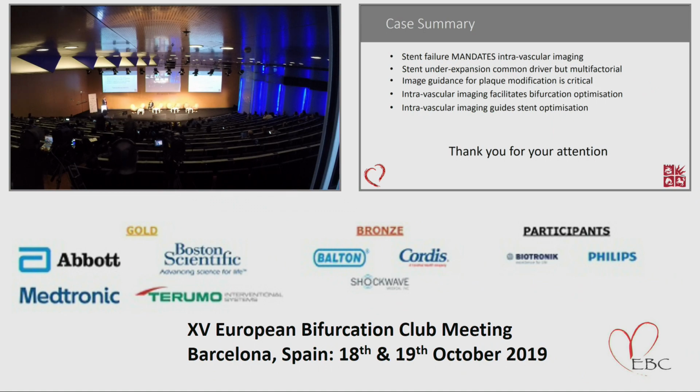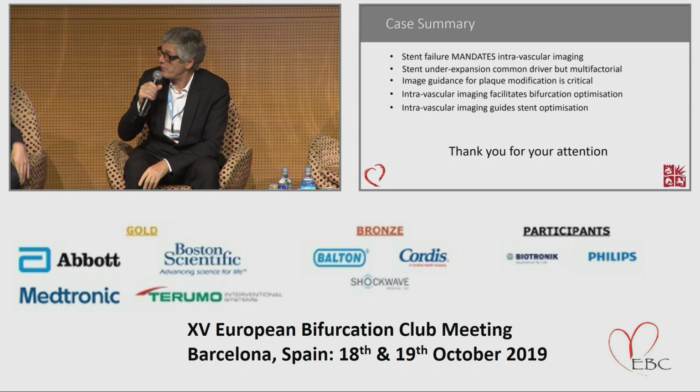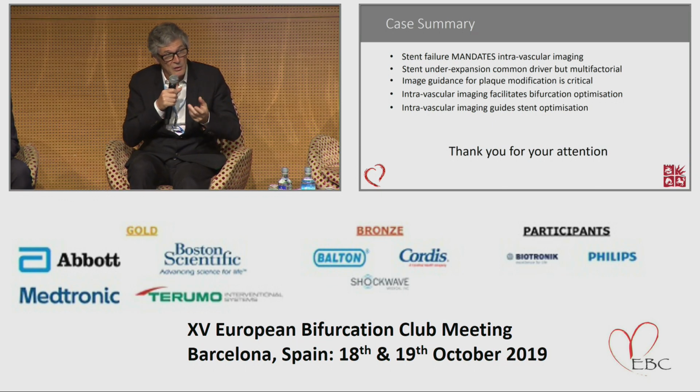Thank you very much, Tom. It was really a great case. I think one of the most important messages is what you said about stent failure. So when you have stent failure, intracoronary imaging is very important to understand what was the mechanism of stent failure and how we can treat the problem. So thank you very much.